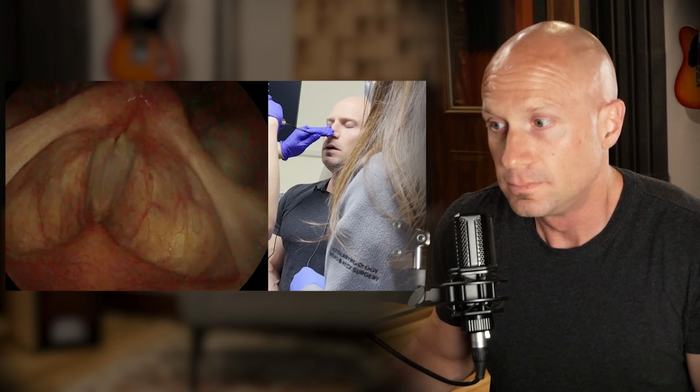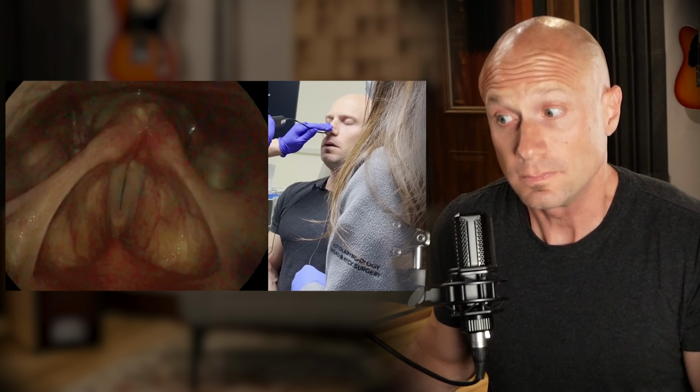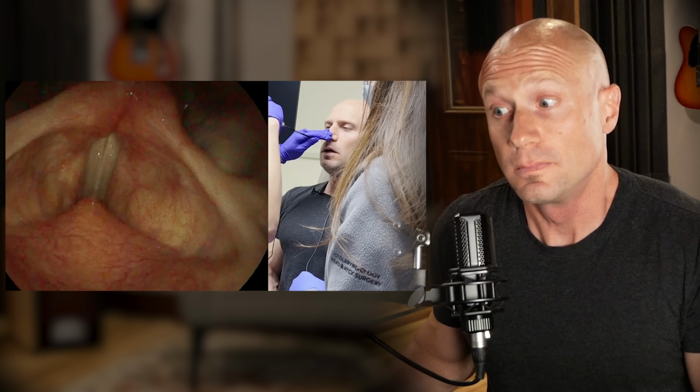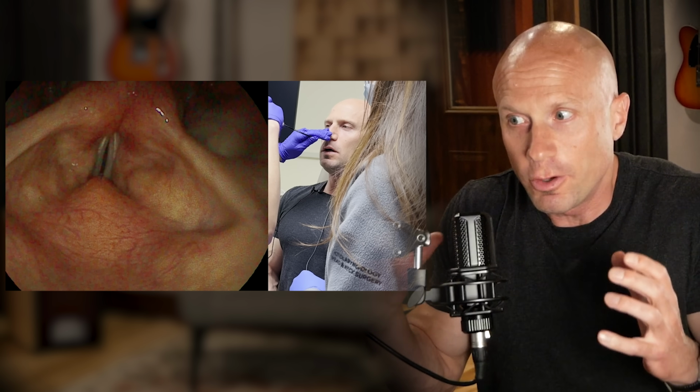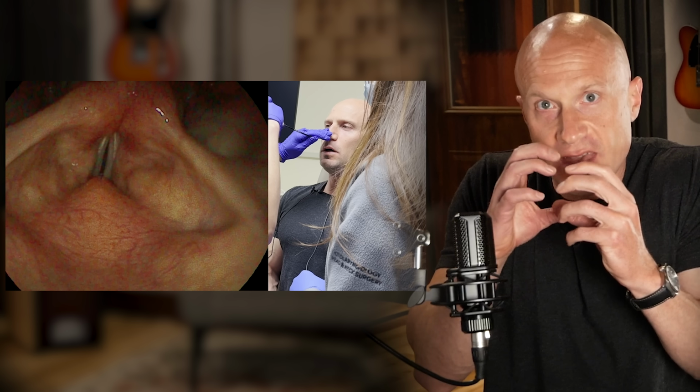Now listen and look as I start in head voice for a very brief moment. The vocal cords look taller, thinner, longer. This is a head voice posture. I don't change the pitch though. I actually go into a different register. I go from head to chest, and you can see when that happens, they shorten. Chest.